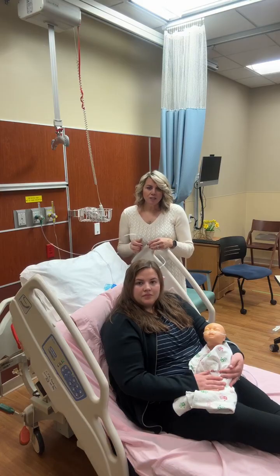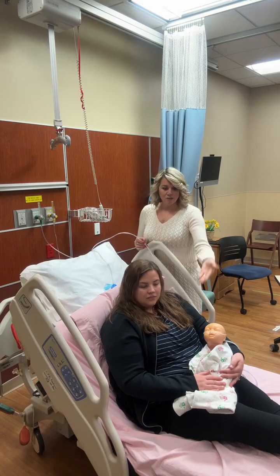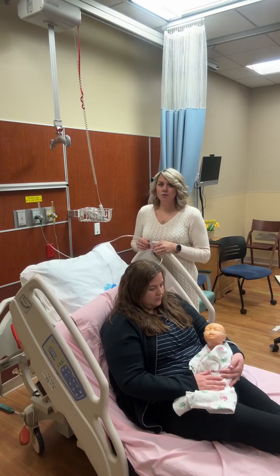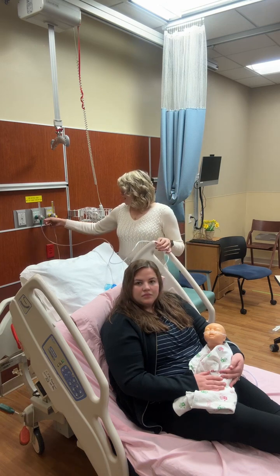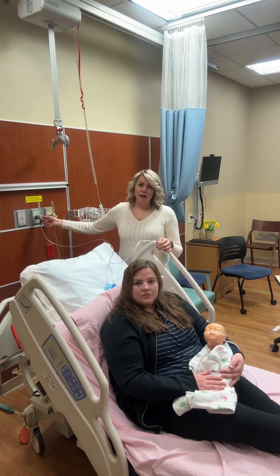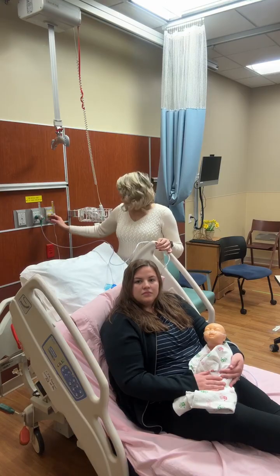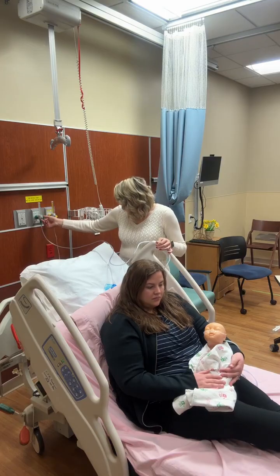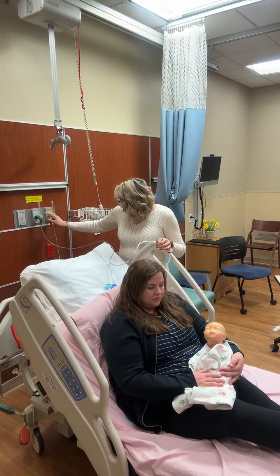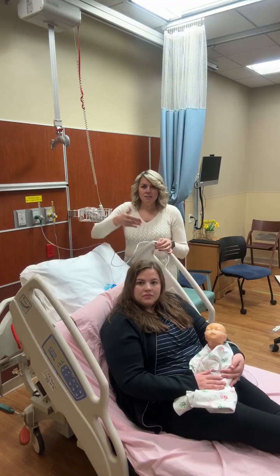So if your patient is cyanotic or their pulse ox, their SpO2 is low, and you can see that the cannula is in their nose, and you see that this is hooked up, make sure that your flow meter is on. Make sure that there's a silver ball that is floating at the prescribed liters. And in this situation, the middle of my ball is right on the 2-liter mark. So that means that the infant is getting 2 liters.